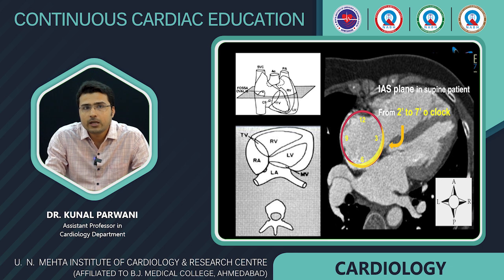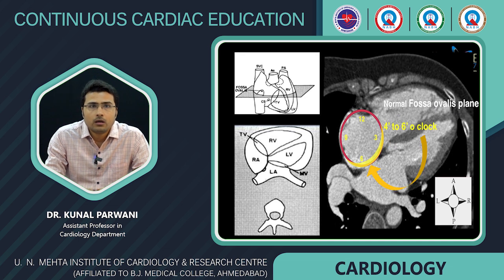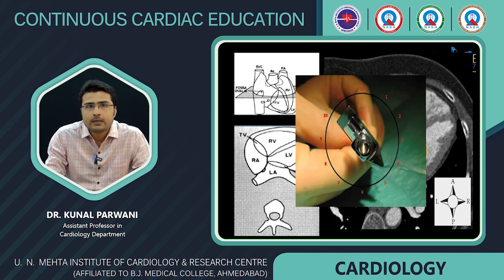You can see in the image from 2 to 7 o'clock position, our needle will be facing the interatrial septum. And at the 4 o'clock to 6 o'clock position, we will be facing the normal fossa ovalis plane. This is the indicator that is available on our Brockenbrough needle, and we have to face the indicator at 4 to 6 o'clock position to face the fossa ovalis.